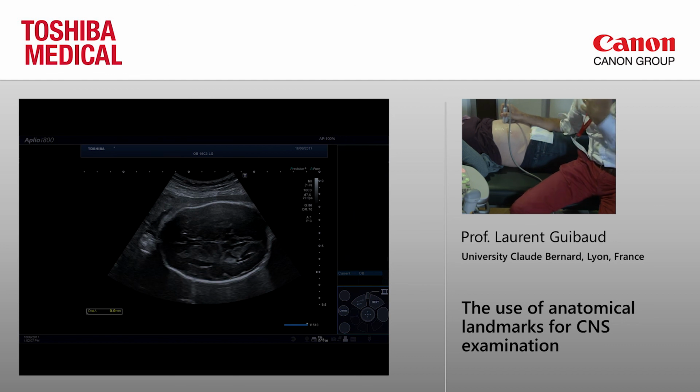When there are no pericerebral spaces, it's very easy. You know that in obstructive hydrocephalus, the pericerebral spaces will disappear. They will increase in two conditions: when there is benign macrocephaly, and they will also increase with microcephaly when there is a clastic event which reduces the volume of the brain.